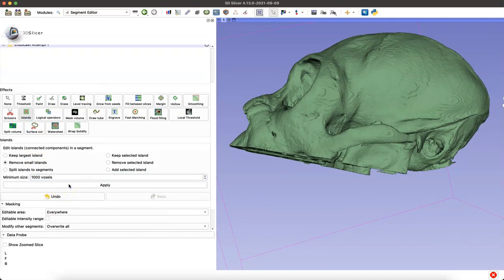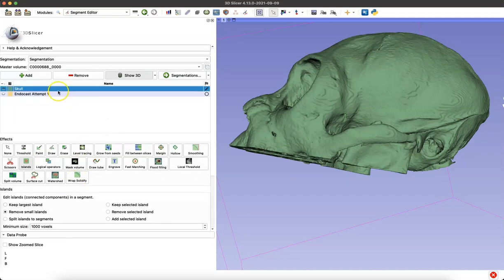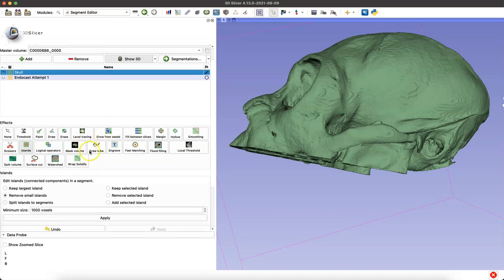Here I use another module called Islands, where I'm removing small islands that are floating around.